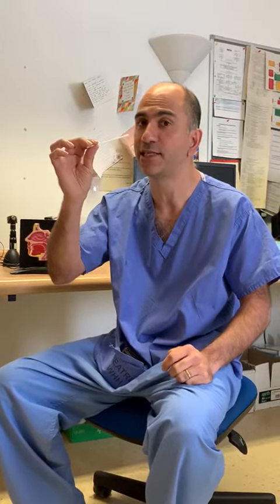And now for the nose — see which one's more open. The right seems to be more open. I'm going to use my right hand for the right nostril, so I can aim a little bit downwards and a little bit inwards, so I don't get caught up on the sidewall anatomy of the nose. And I'm going to push all the way back to 7cm. A bit uncomfortable — nice pill rolling — get lots of secretions and come out.